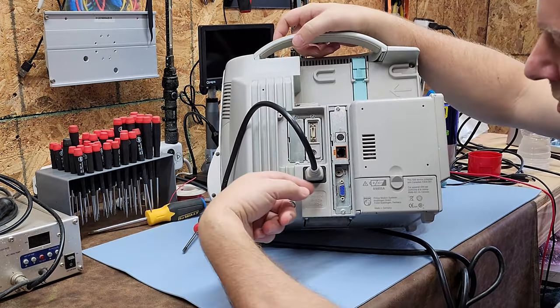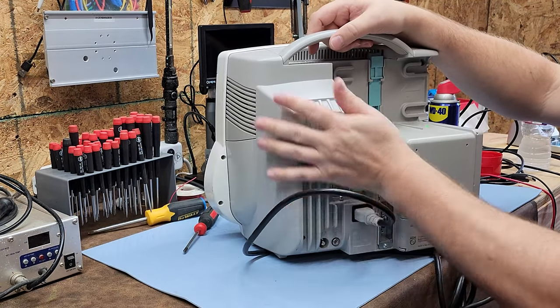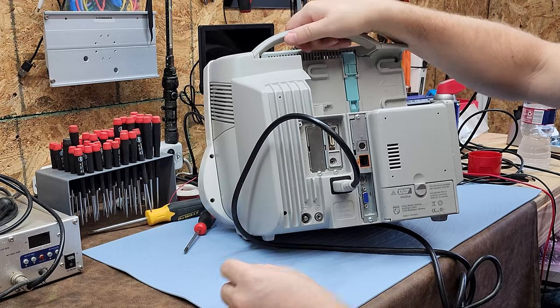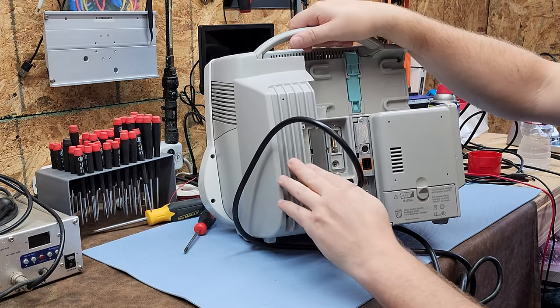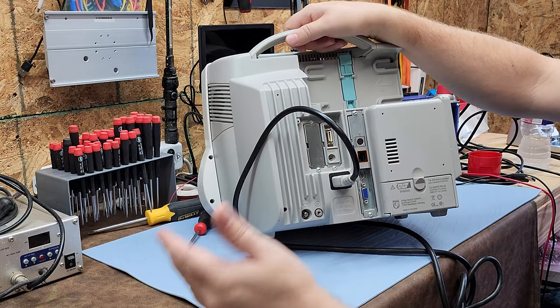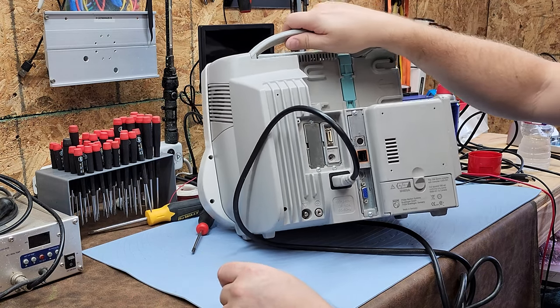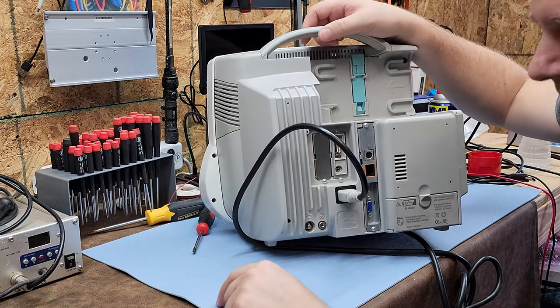Here is the IEC power inlet, which means the power supply is embedded. You can see these large cooling fins — anytime you see fins like this it's because the power supply is integrated. That's probably where you'll have most of your problems, because power supplies are the Achilles heel of almost every medical device.